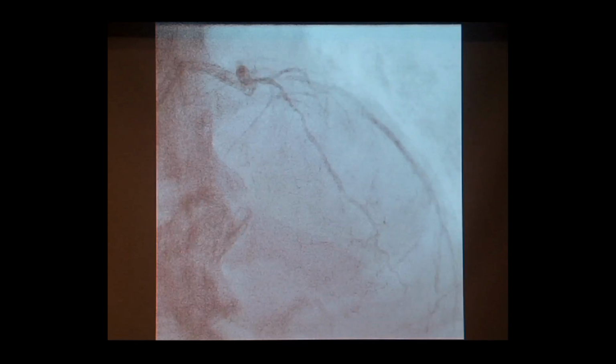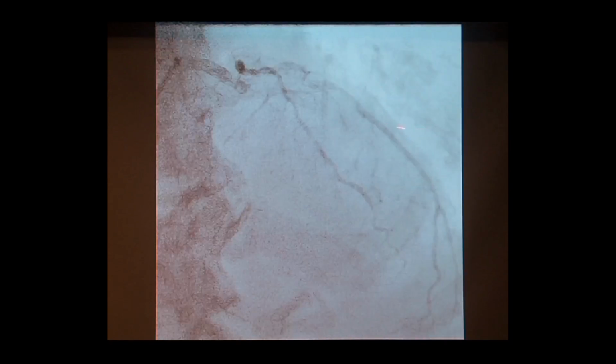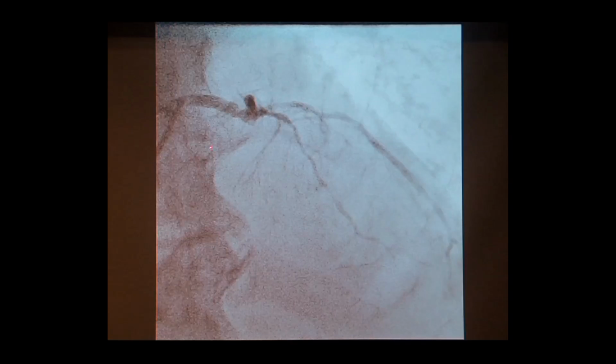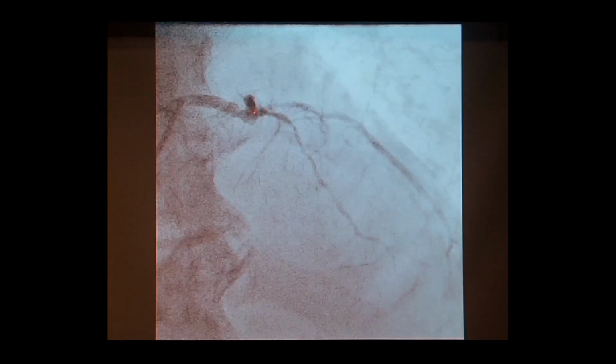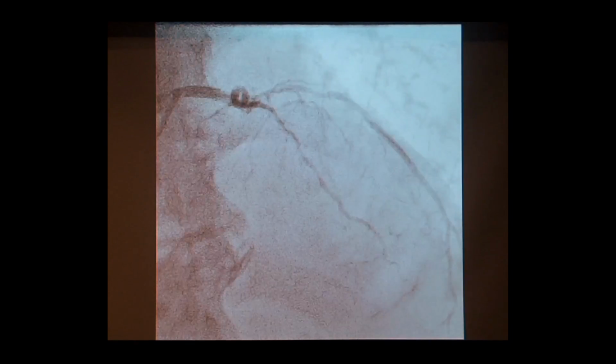So here, this is the left coronary artery system. And essentially, as you can see, that is the circumflex artery, which goes around there. And look at here. Is there anything you see there? Nothing. So what's happened is this unfortunate gentleman's artery, the LAD artery, which I also referred to previously, the widowmaker's artery, is kind of blocked right up there. So now the task for us is to try and reopen this to get blood flowing back to the heart again.